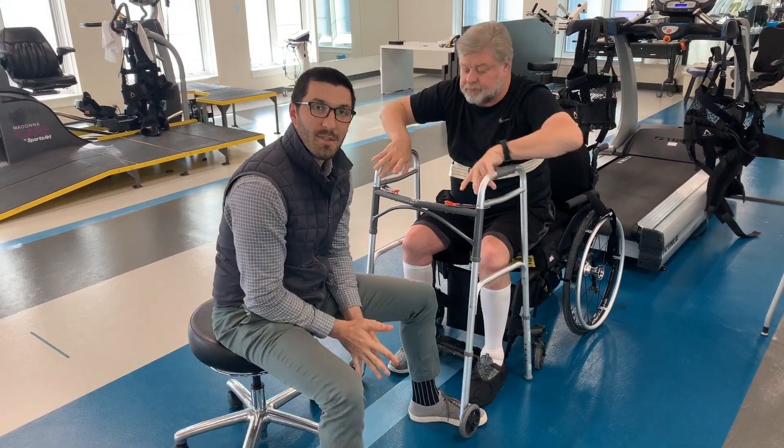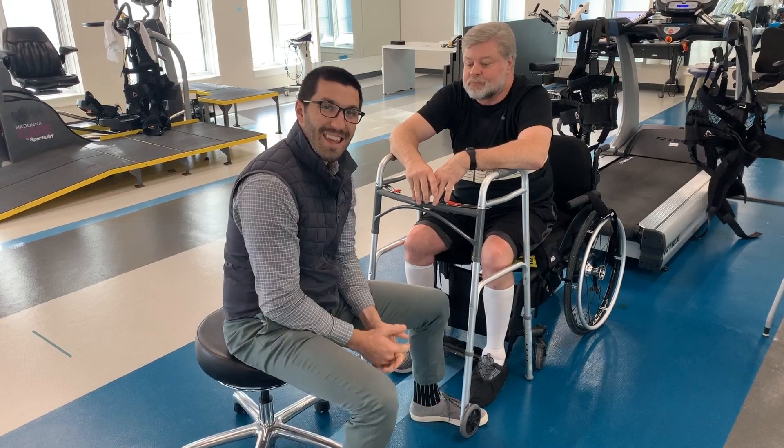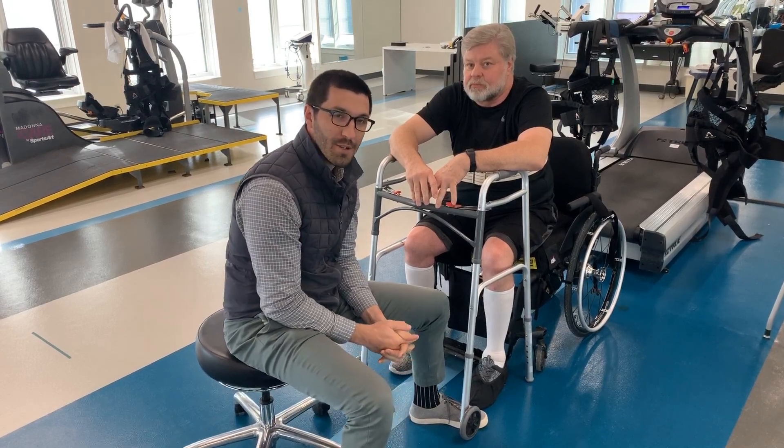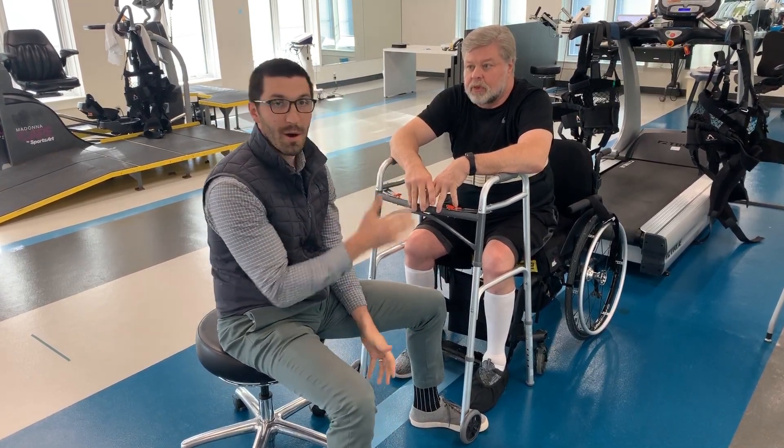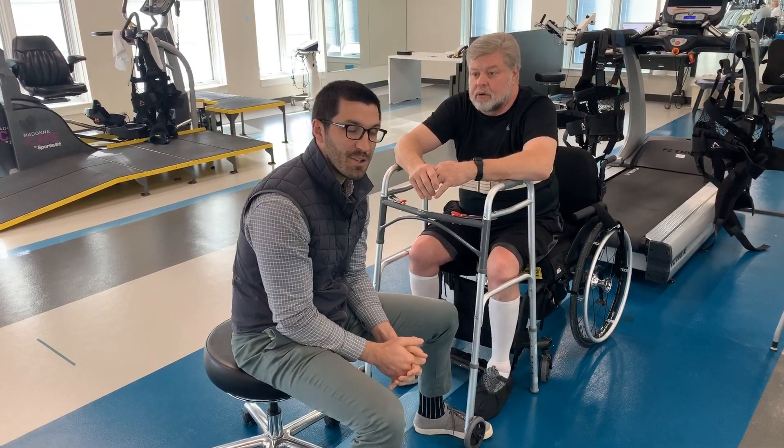Hi, I'm Brad Dexter, Physical Therapist at QLI. This is John. John has a T9 Asia-D spinal cord injury and just in the last couple months has progressed from an Asia-C injury to an Asia-D type of injury.